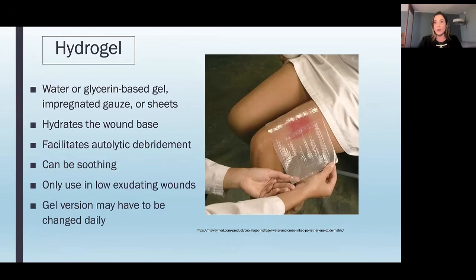But there are a wide variety of options out there. So just know what your options are. I think that every institution should have at least one hydrogel on formulary as an option. In my patient population, I don't use hydrogels a whole lot, but when I need to, I love it.